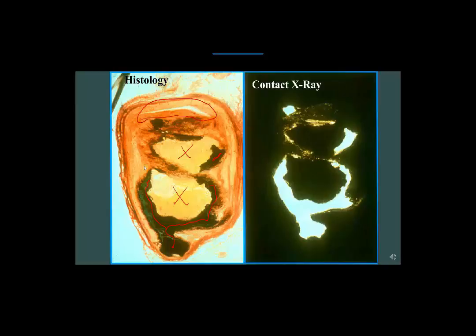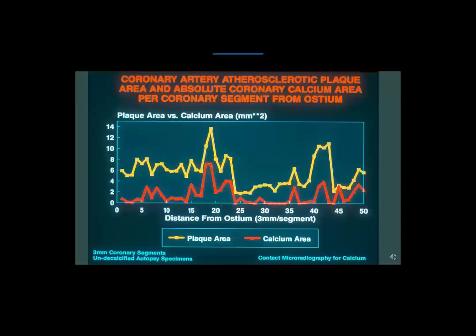You'll also notice there are other areas with green birefringent material. These are areas where the Mason-Goldner trichrome stain picks up what's called calcium hydroxyapatite. Next to this is a contact microradiograph of exactly the same coronary section. The areas of calcium hydroxyapatite correspond directly with areas of calcification noted in the same histologic segment, indicating the standard association of coronary calcification seen on x-ray with the actual finding of calcium hydroxyapatite.